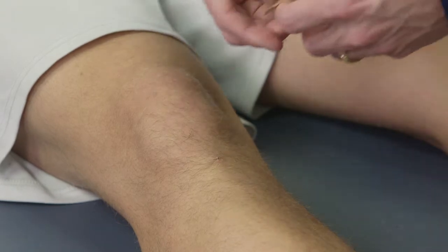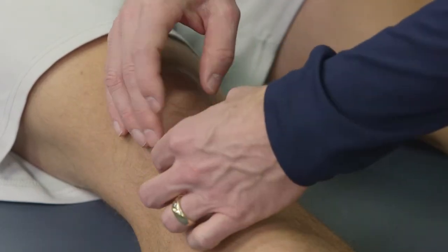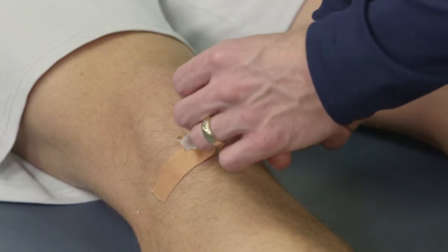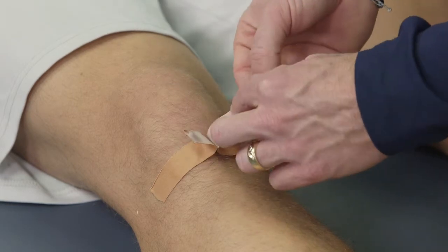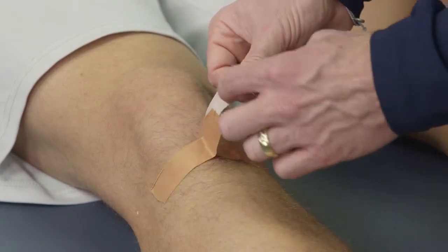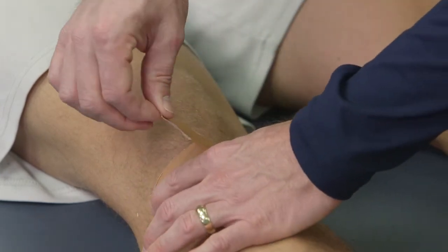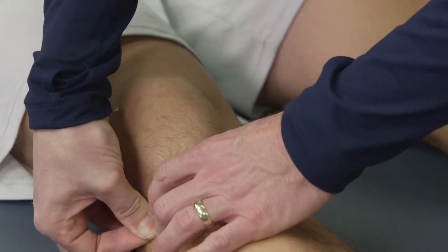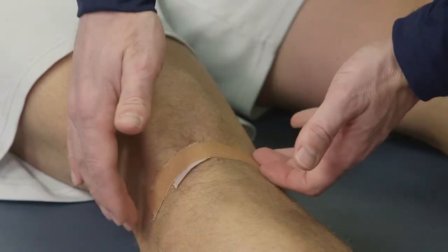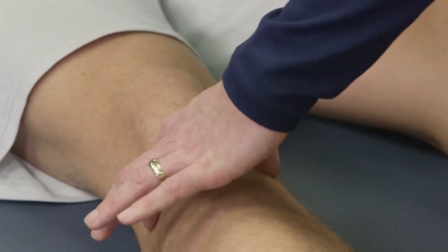What we're going to do is take this piece of tape, lay it down, and fold it over in half just like that, and apply that and make it nice and secure. We're going to take our other piece that's just a little bit longer and do that same thing, then pinch and attach these together. I want to secure these down — there's a stickier tab here that's going to come down and adhere directly onto the skin. I'll pull down as hard as I can because I want as much of that tape secured onto the leg as possible.